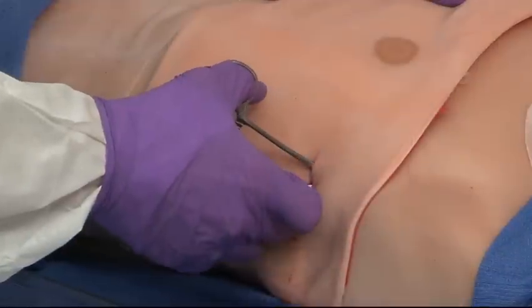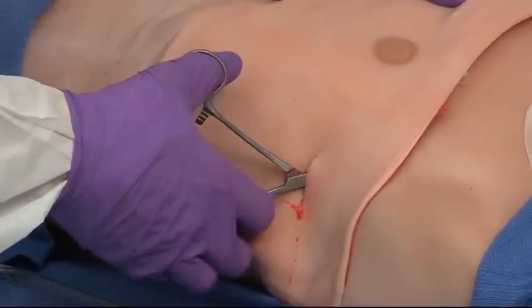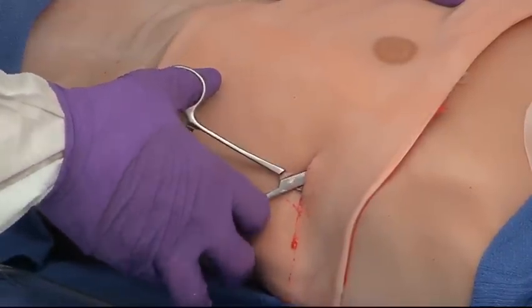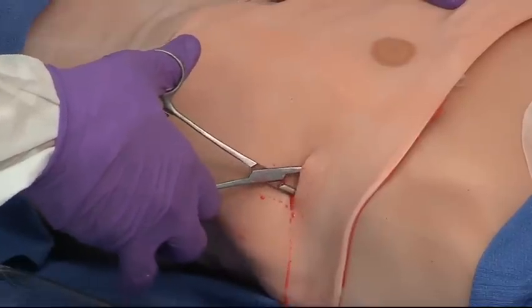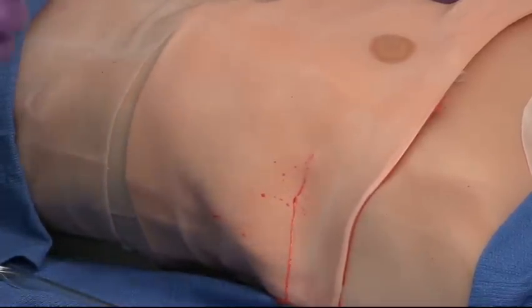Once you've done this, you want to then spread, close your clamp a little bit, spread again. The idea here is you want to make a hole large enough that you can put both your finger in, first of all, and then this large tube once you're done. I now have a hole in the chest.